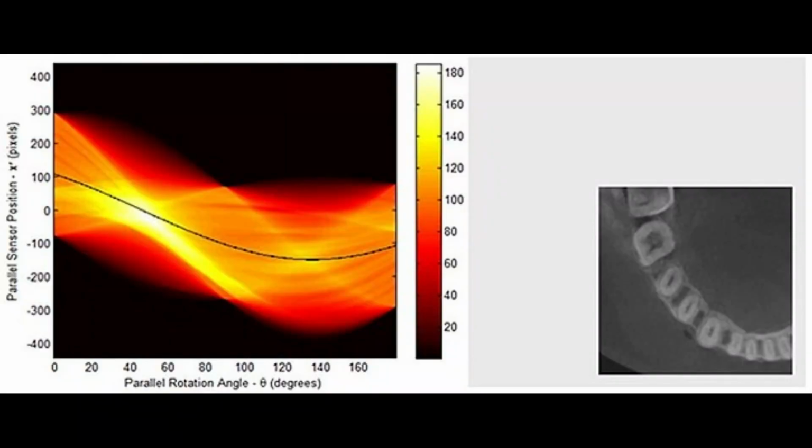On this image, on the left is a sinogram, or a graphical representation of the data received, and on the right is an image sample derived from raw data. The sinogram would not be any use for a radiologist or a doctor, but the recreated image can give valuable information about the body to a trained radiologist or a doctor. These images show your organs, bones, blood vessels, and any problems like tumors or injuries.